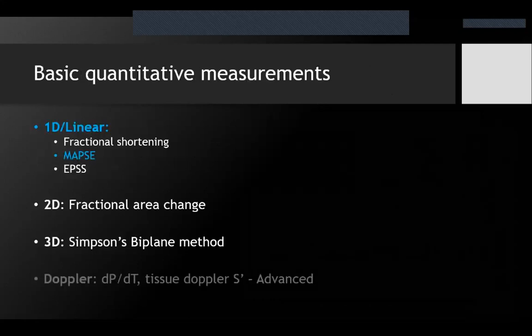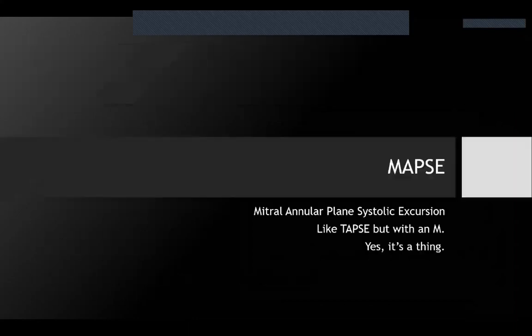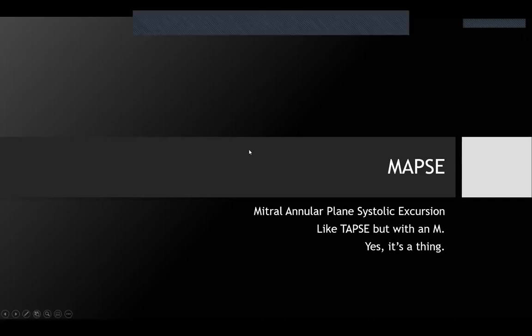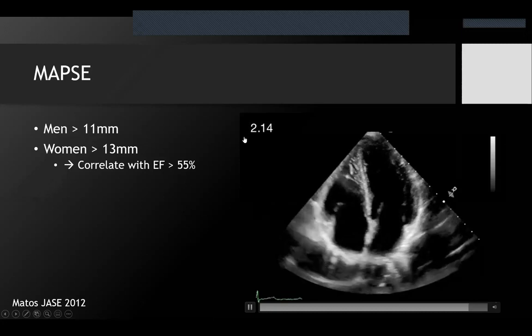Okay, so I'm going to move on to MAPSE. MAPSE, if you've heard of TAPSE, this is just MAPSE on the other side. And yes, it is a thing, and no, it's almost never done. But the reason I'm sharing it is, again, to completely reiterate, not so that people should go measuring MAPSE in everyone, but so that you should be able to do it enough times to train your eye to see it without measuring.